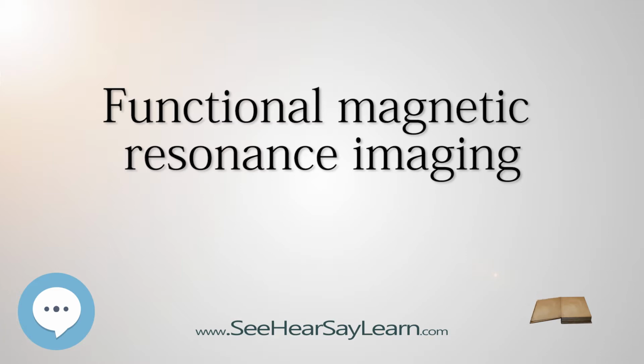In 1997, Dale and Buckner tested whether individual events, rather than blocks of some duration, also summed the same way, and found they did. But they also found deviations from the linear model at time intervals less than 2 seconds. A source of nonlinearity in the fMRI response is from the refractory period, where brain activity from a presented stimulus suppresses further activity on a subsequent, similar, stimulus. As stimuli become shorter, the refractory period becomes more noticeable.